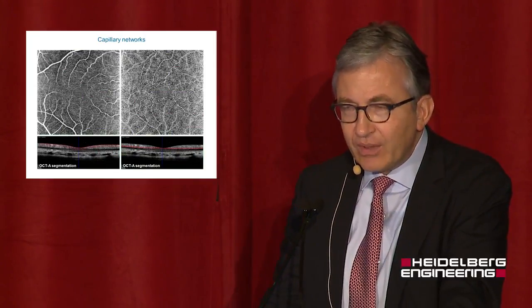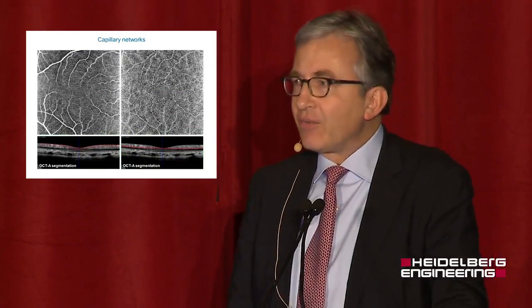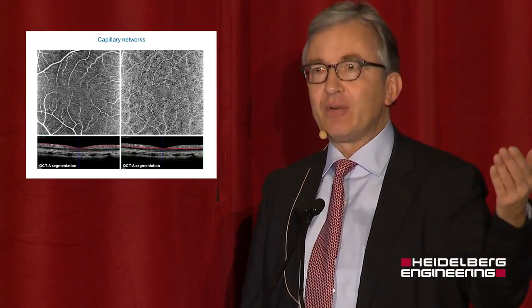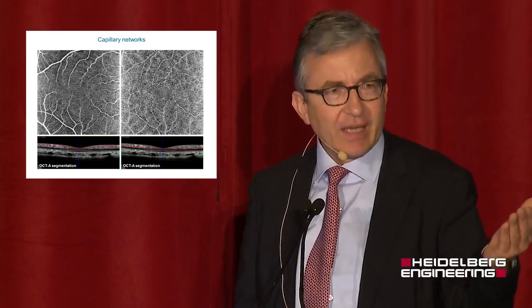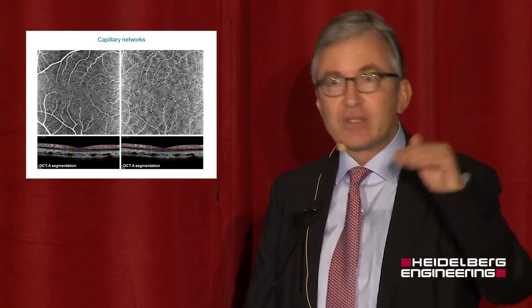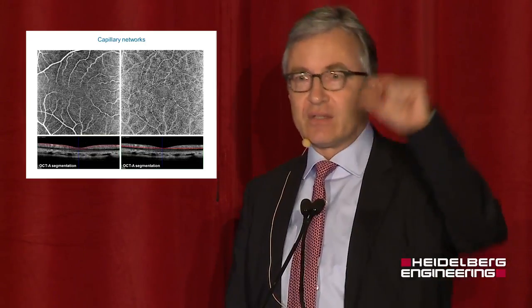And the wording that has already been introduced in looking at the inner and the deep capillary plexus is an oversimplification, as we will see in a second, in that it's not just a two-layered system, but it's more refined and we have now more granularity.